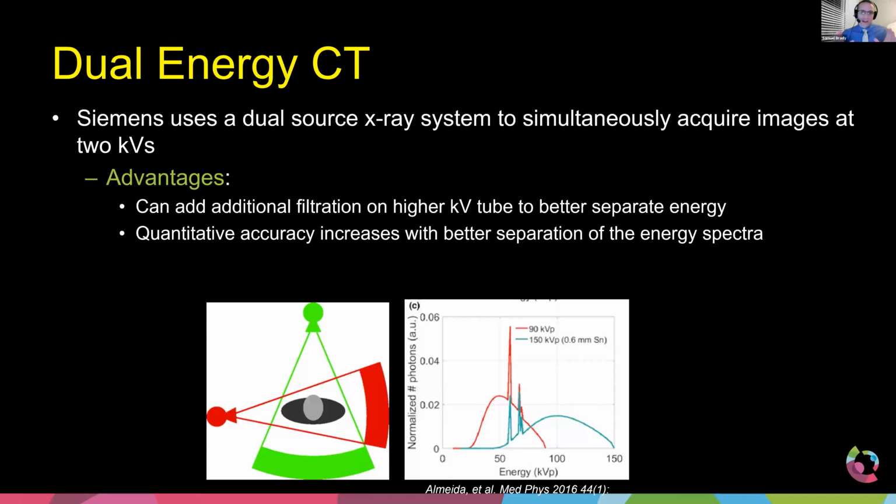Let's be honest here for a second. If I put a dual energy image from a Siemens scanner, a dual energy image from a Philips scanner, and a dual energy image from a GE scanner up, and I didn't tell you which one was which, could you tell me the difference? Probably not. We talked about all of the advantages and disadvantages of each of the systems, and that is simply because when it comes to setting the right noise and the right dose, each system is slightly different.